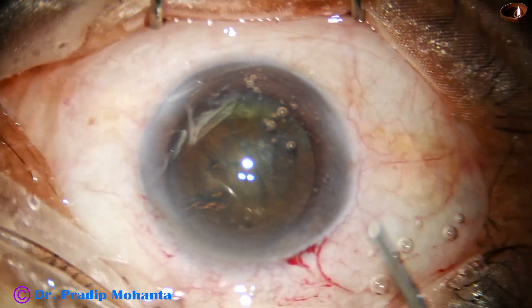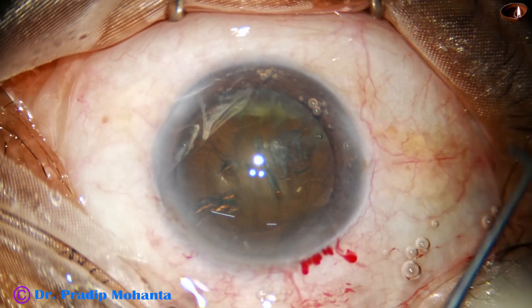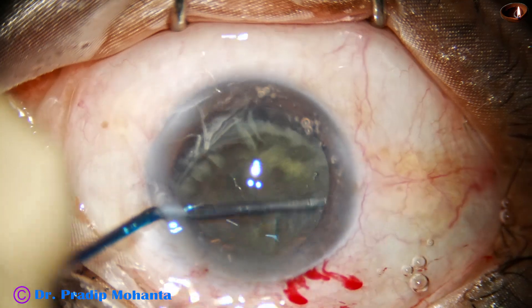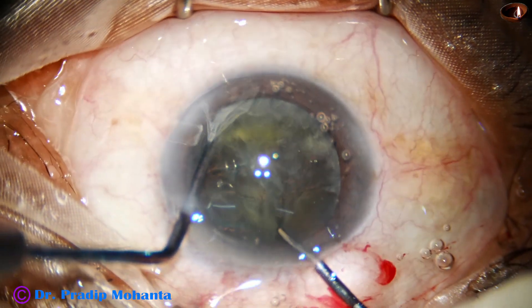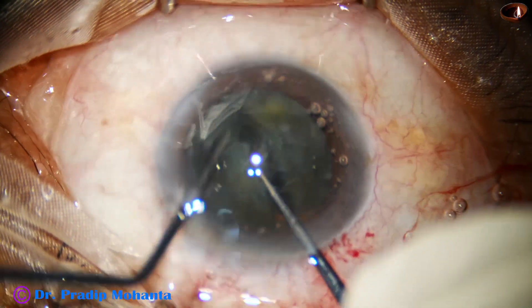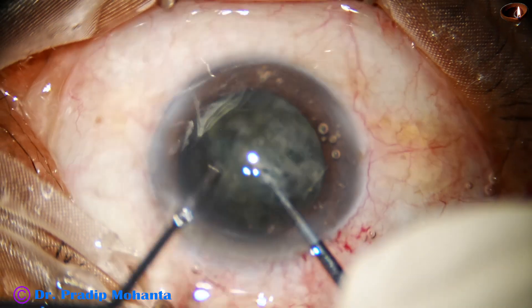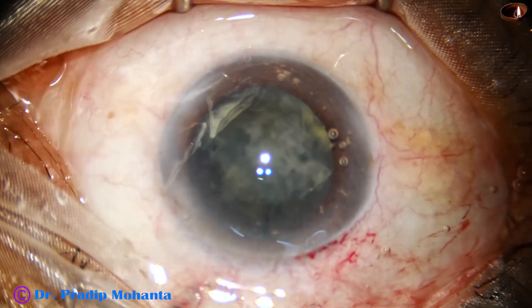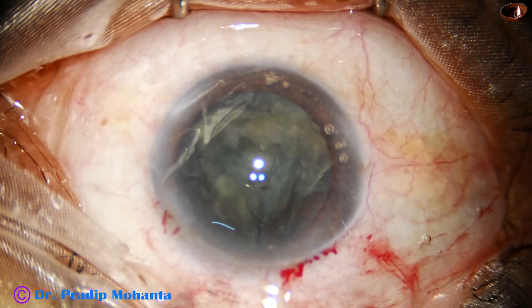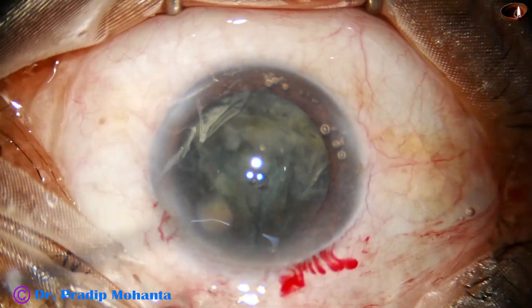Now I'm going to use the pre-chopper designed by me. The pre-chopper goes through the main wound, and through the side port goes the nucleus sustainer. The two instruments are brought together and we cut the nucleus into pieces. The nucleus has been divided into three pieces: one hemi-nucleus, and the other hemi-nucleus has been divided into two fragments.